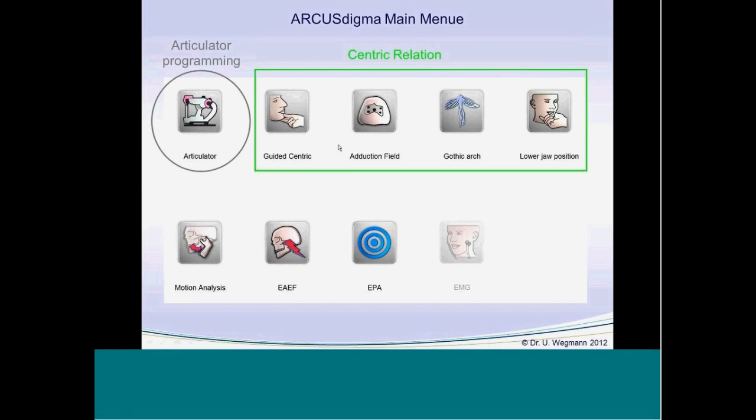But you are used to different kinds of systems, how to position the lower jaw in the right centric position. And therefore, you can find here 4 different buttons for different kinds of centric records.